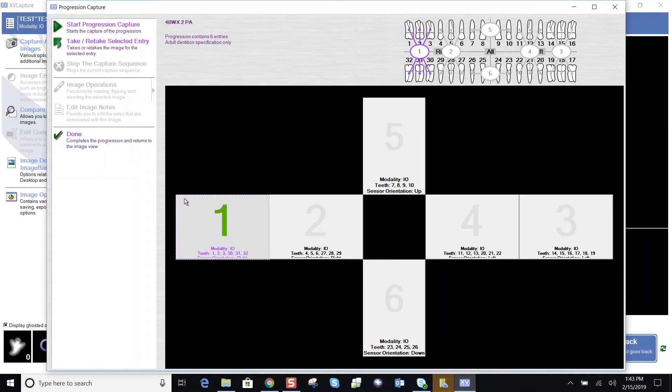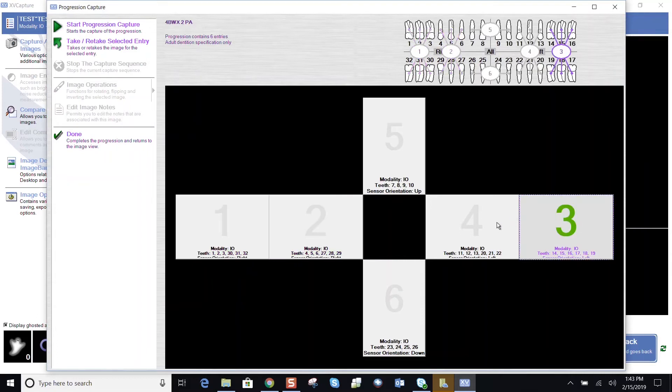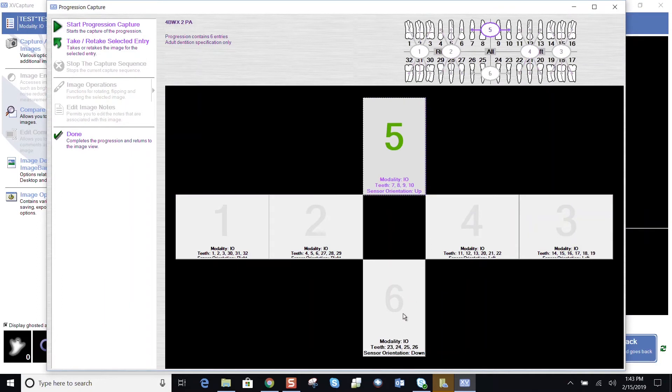Perfect. You see, moving from the patient's right, one, two, three, and four. Upper anterior five and six.